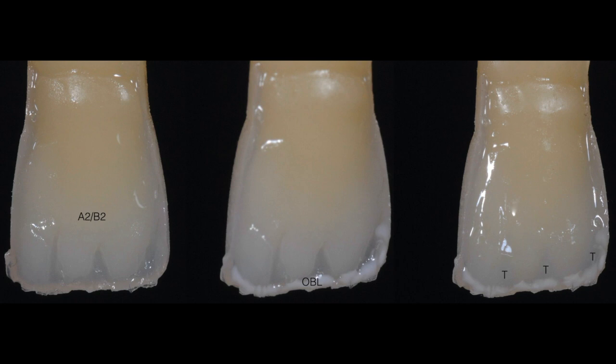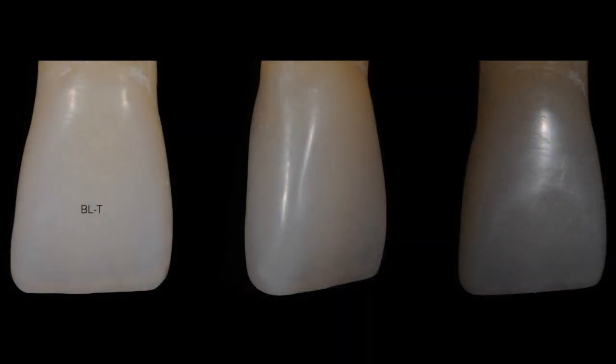This is followed by adding a 0.5 layer of opaque bleach to recreate a halo effect as seen in young patients. In the space left between the mamelons, I am going to add some translucent enamel. And finally, I am going to add the last layer using bleach translucent enamel. All these shades are in the Brilliant EverGlow kit.